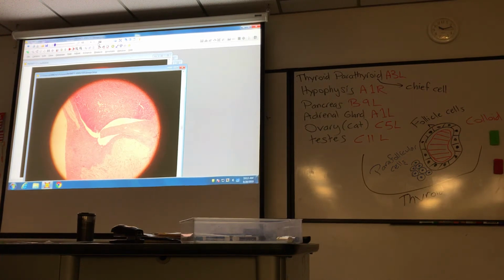Any questions on that one? Posterior is typically lighter, you said? Yeah, that is correct. Posterior is the lightest stain, and what's the darkest? Anterior. And pars intermedia is an intermediate stain. Okay, moving on. Is there anything else? No, that's everything. I'm looking at the study guide. I'm going to proceed.